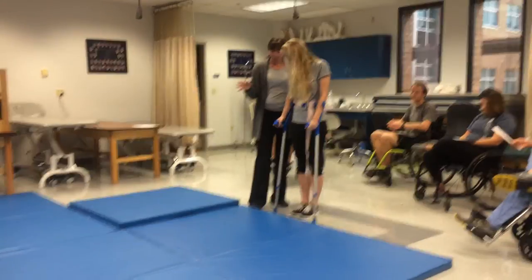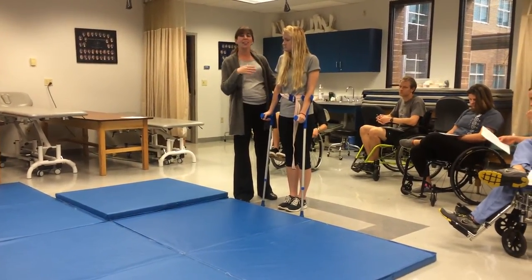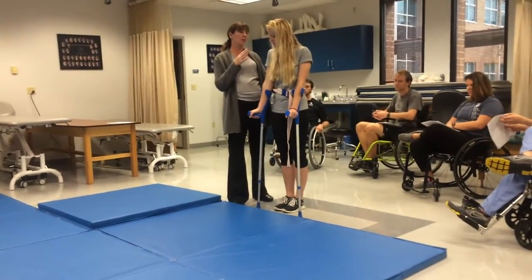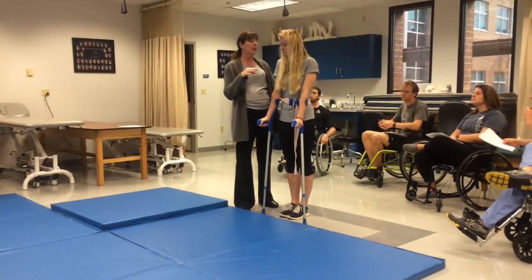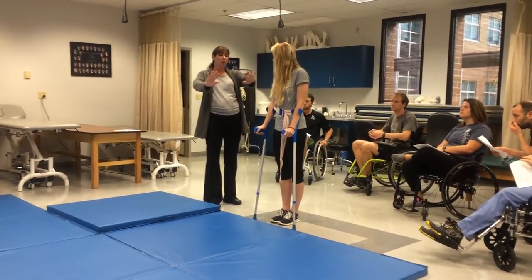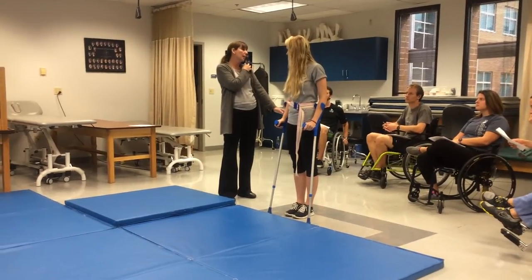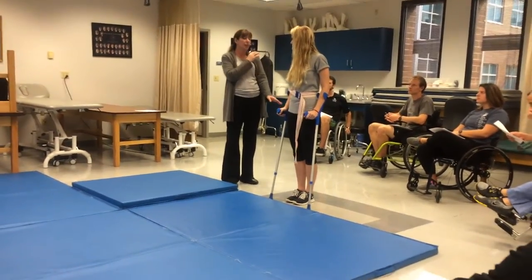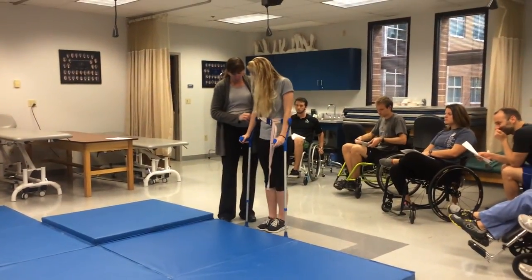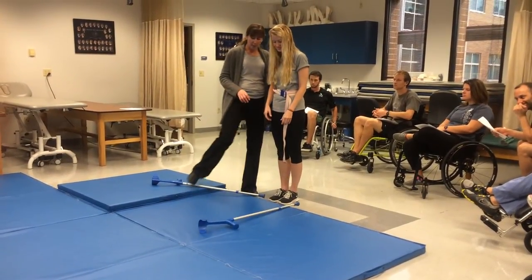For stand-to-floor falls, you would practice safe falling in therapy. If you were to fall, the best way is to fall forward, almost landing in a push-up position. You don't want to fall with your elbows locked, because there's an increased risk of shoulder dislocation and AC joint separation. If you can land with elbows slightly flexed, the crutches go out to the side a little but not too far. As a therapist, you help them jackknife down — guarding by the gait belt, helping lower them down.